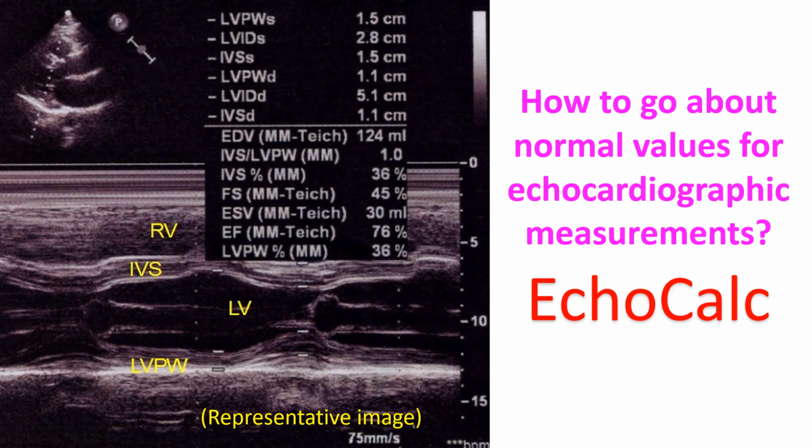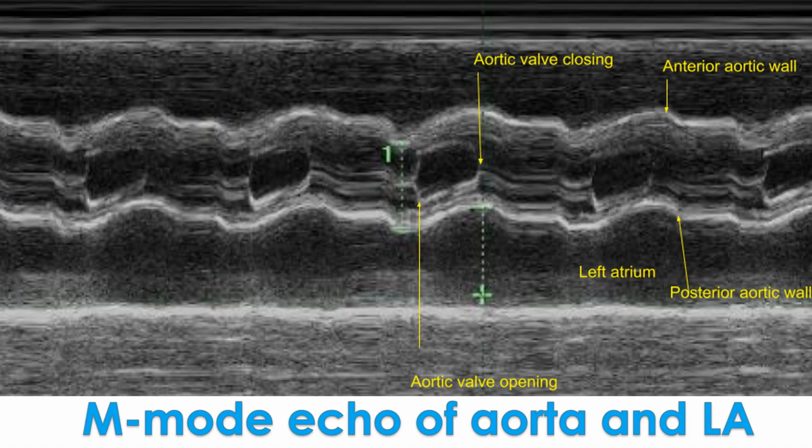There are a few useful tips for visual assessment during routine echocardiography. Most of the chamber sizes are checked in diastole except the left atrial diameter, which is measured in systole. Of course, left ventricular dimensions are measured in both diastole and systole. In general, left atrial and aortic diameters are roughly equal when seen from the parasternal long axis view. So it is easy to make out enlargements, though this does not apply when both are dilated.